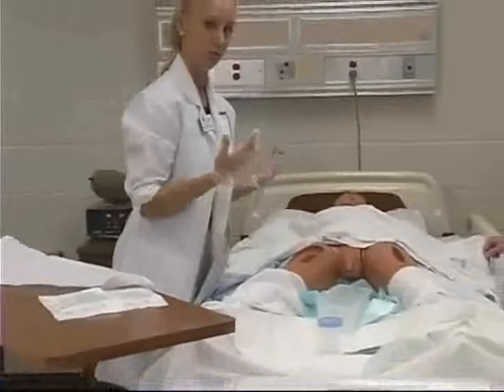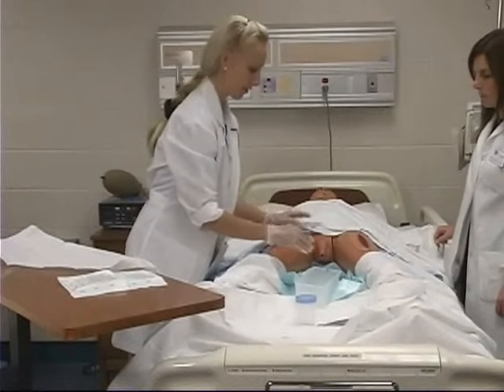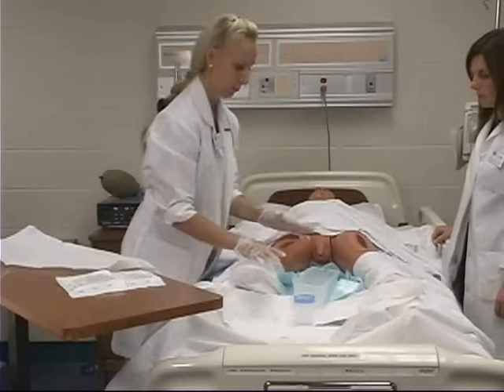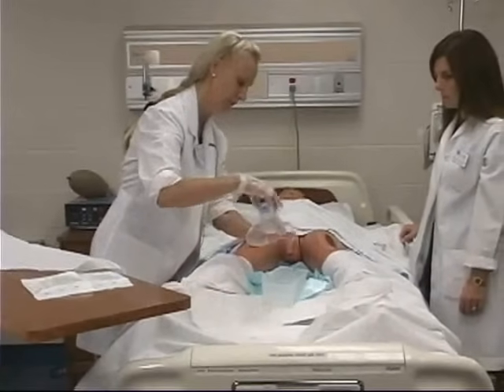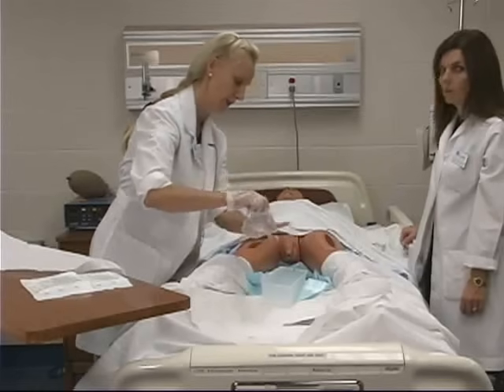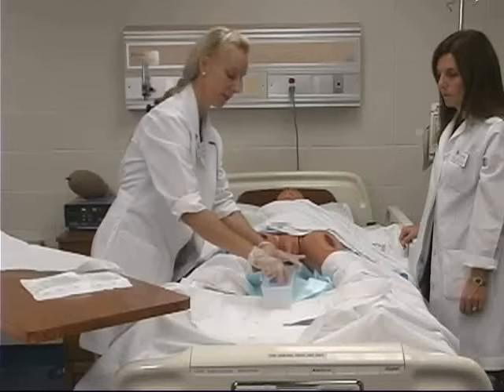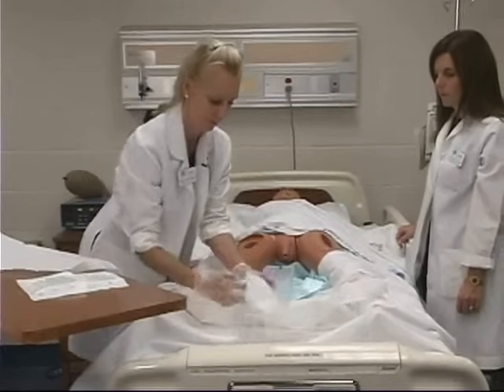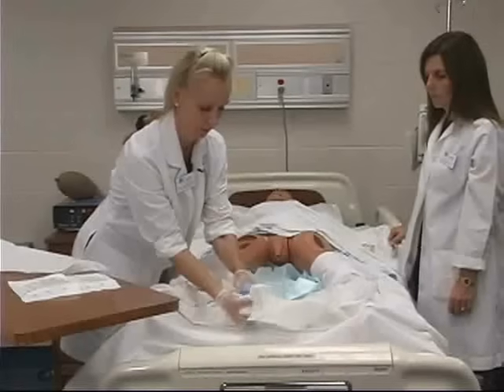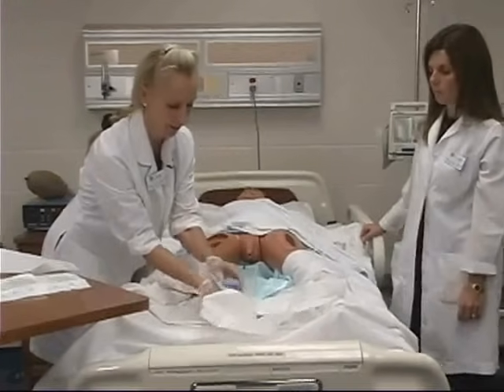At this point, the procedure's done. You can take care of the patient and wipe him up. I have my urine here — I didn't get the lid on tight yet, so I'm going to tighten this up. Be aware that some urine might have gotten around on the cup since I had my specimen container inside here. This is going to be placed in a bag before it's sent down to the lab.